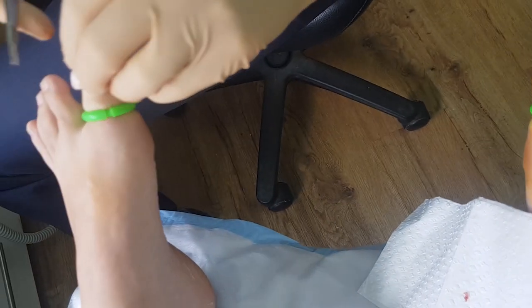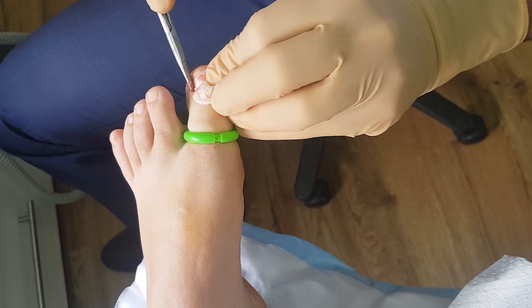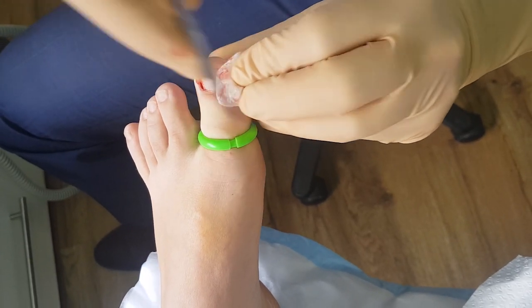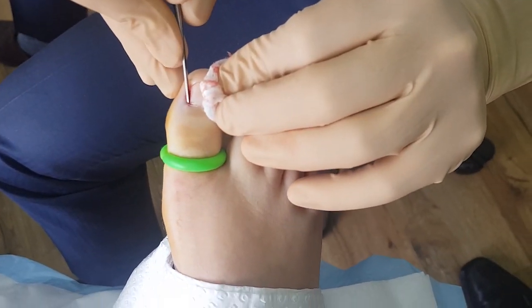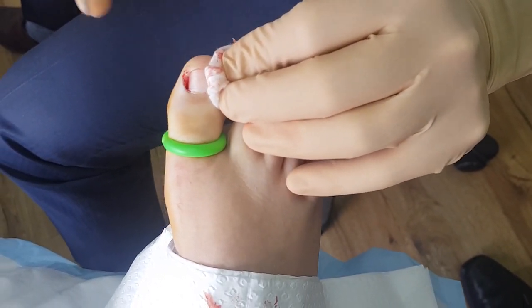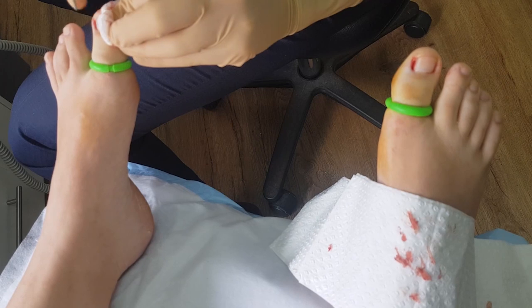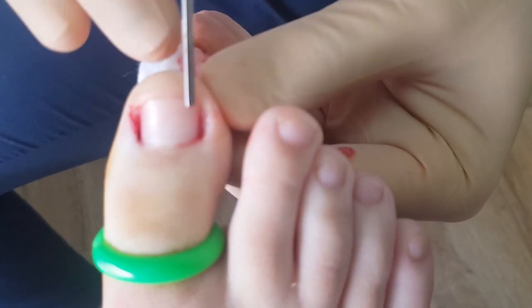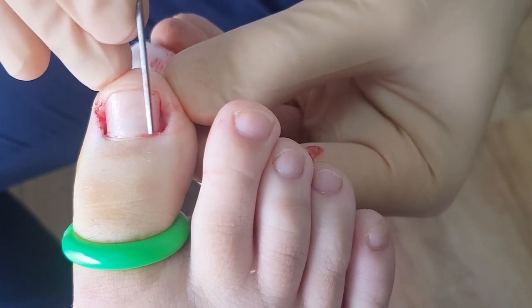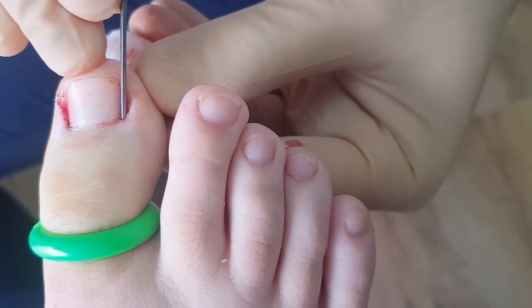Then we're going to make sure that those cuts were nice and straight after we get the nail out. Just checking — nice, good. That's also straight, and you can see that this portion of the nail has not been lifted at all. So if you've got the elevator and started sticking underneath with the Thwaites, you're guaranteed to lift a couple of millimetres on that portion of nail. It's really well attached and it will minimise any chance of phenol getting underneath there.